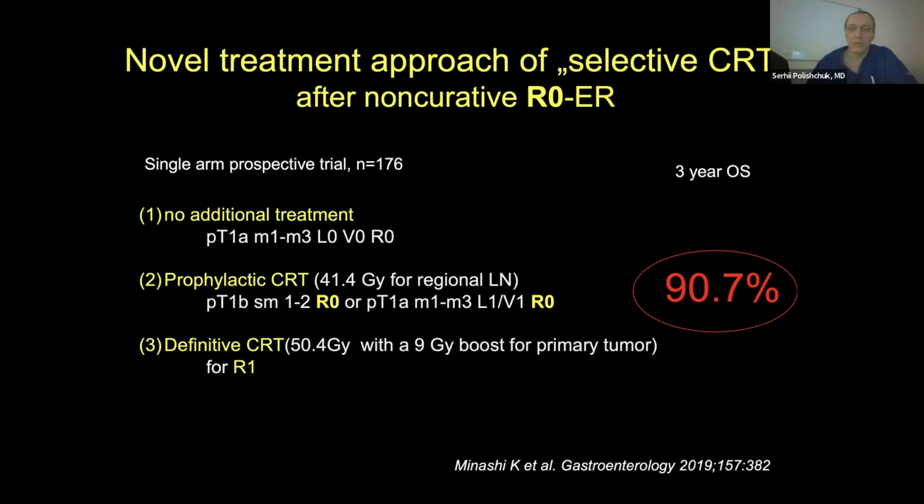Can I ask you about the new IPCL classification? One question. We know that if we have A classification, not B1, B2, or B3, it may be normal, it may be inflammation, or it may be low-grade dysplasia. So we don't have any normal sign. What type of tactics do we need to choose if we reveal A classification of IPCL? What is the tactic? Because it can be not only normal but low-grade dysplasia also.